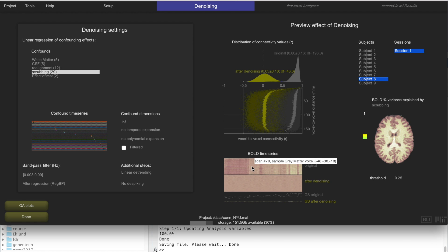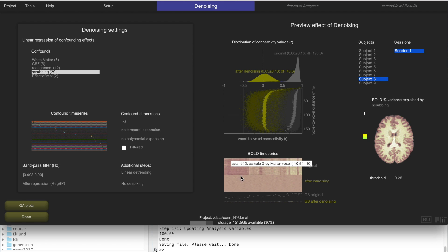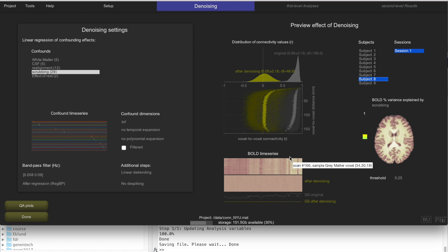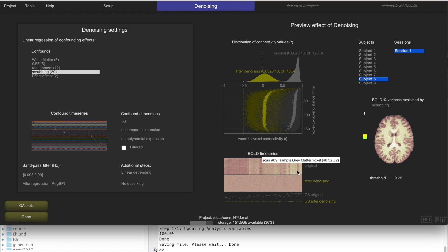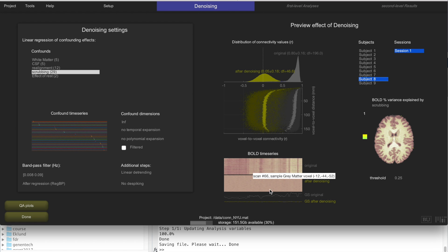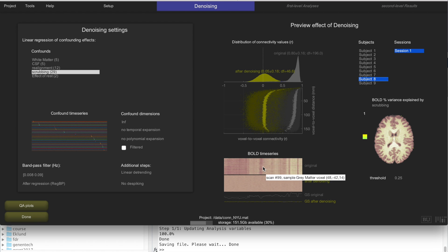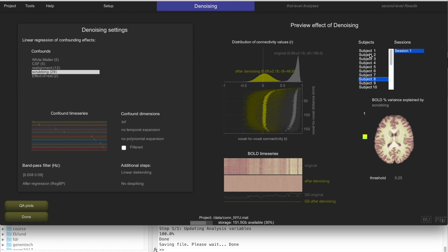You can also look at carpet plots, which show the BOLD signal time series — the time dimension on one axis and voxels on the other. When you see patterns in these plots, that means there are still residual global effects on the signal. This is before denoising, and this is after denoising. After denoising you shouldn't see any pattern — that's an indication that everything is working fine.